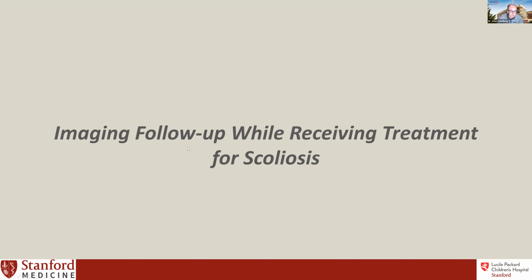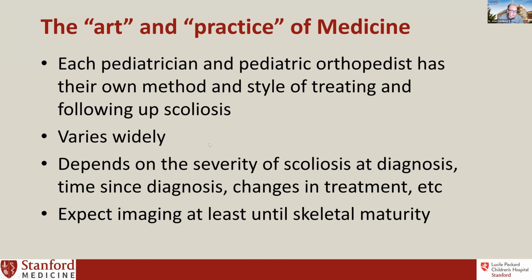So finishing up here, imaging follow-up while receiving treatment for scoliosis. This is really the art and practice of medicine. Each pediatrician and pediatric orthopedist has their own method and style of treating and following up scoliosis. It varies so widely here. So I really didn't want to go into detail on this because your orthopedic surgeons are the true experts, and they utilize all the information we provide to them to make the best determination for your child. And it generally does depend on the severity of the scoliosis at diagnosis, and as follow-up progresses. But you should expect imaging at least until skeletal maturity, from what I've generally seen at my institute.